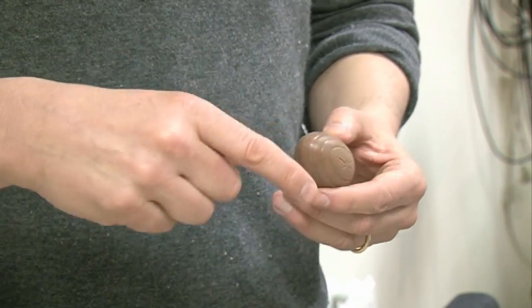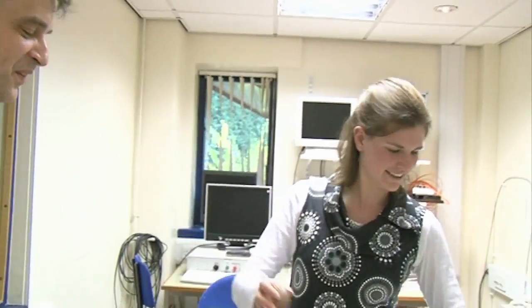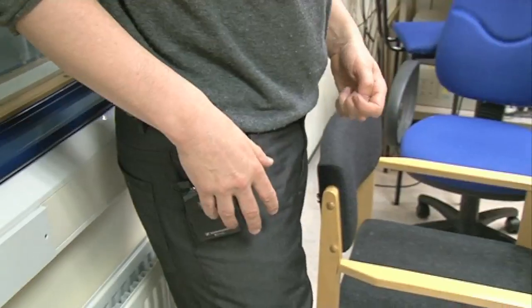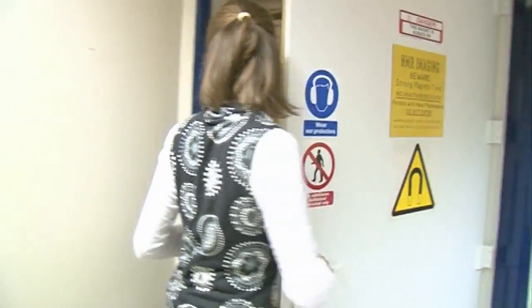Probably what we're most likely to see in the cream egg is the fat present in the chocolate and also in the cream filling. So this is Karen, who's going to put the things into the scanner because I'm wearing a mic which I can't take into the magnet.